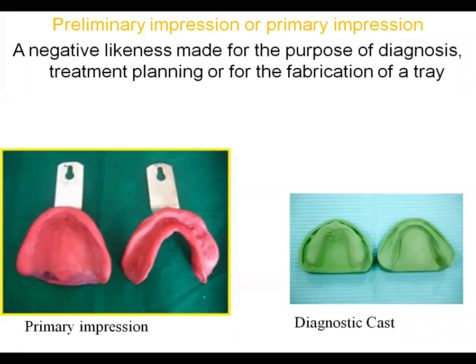Okay, so here we do beading and boxing of this primary impression, and pour a nice diagnostic cast. As far as your diagnostic cast is concerned, what is important in it? This is fabricated for diagnostic purposes only.